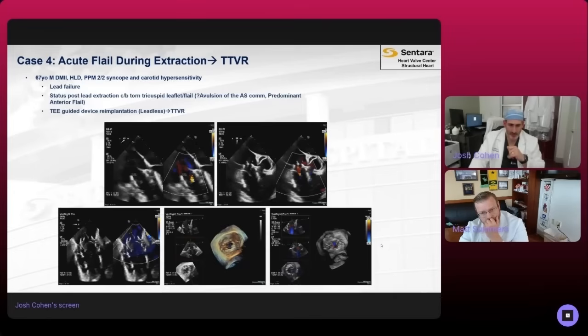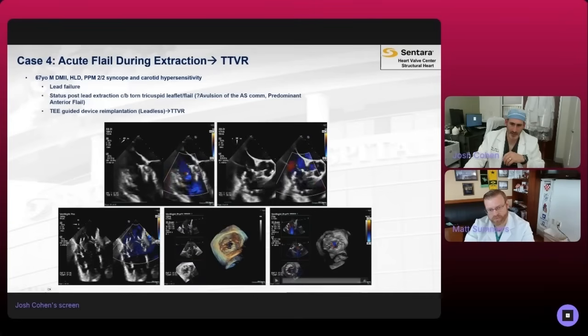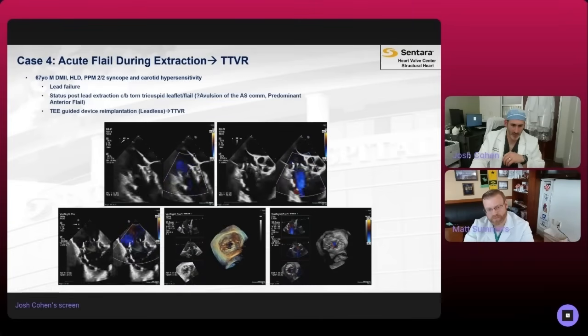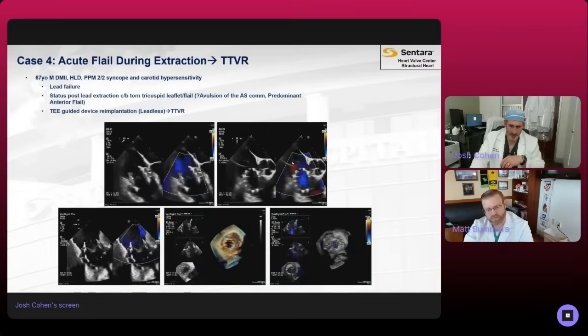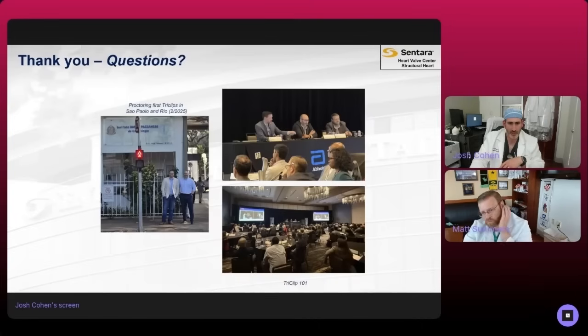And so then, we have a nice, working tricuspid valve. There's a trivial amount of valvular leak there. You can see, I think, some of that Chiari left near that valve. Really nice ICE images here as well. And then just showing 3D images on ICE as well. No paravalvular leak, valves functioning well. And that gentleman did really well.